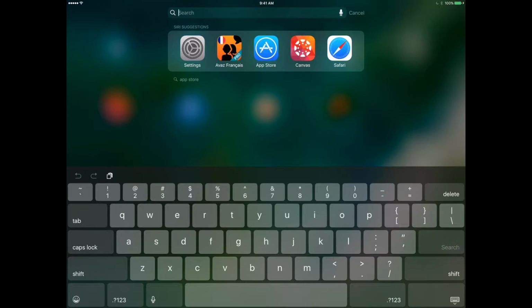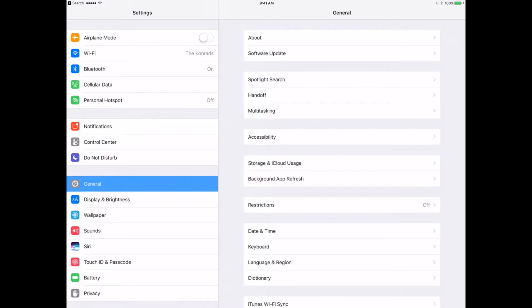So let me first show you in the settings what would need to be done. And the actual process of setting it up is not as bad as the execution. I have had this weird technical difficulty where I'm having trouble with all my switches right now. All of my good ones are out on loan to students. So what I've done here is I've set up a head movement switch process, which is kind of funny because I'm dancing around the house, moving my head in different directions, but that's okay.